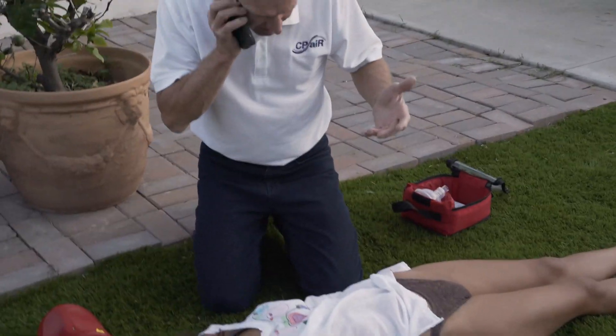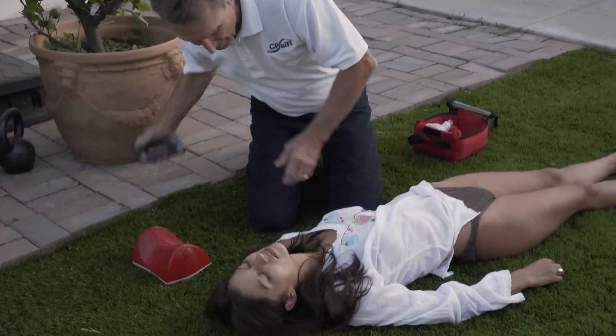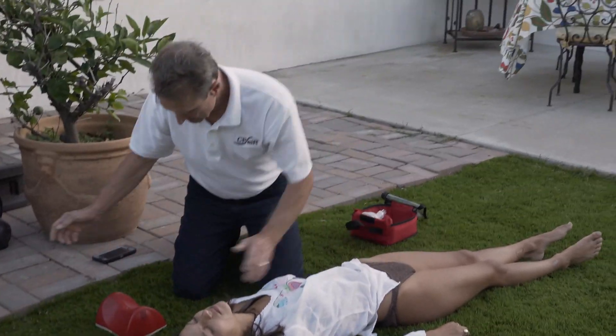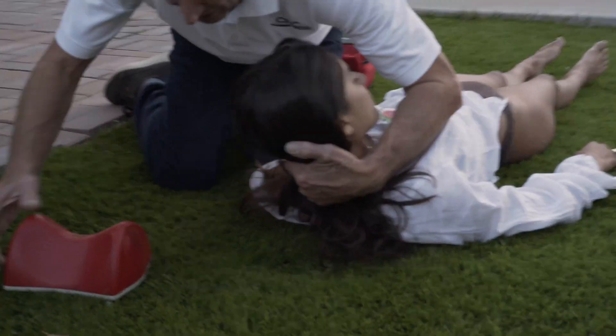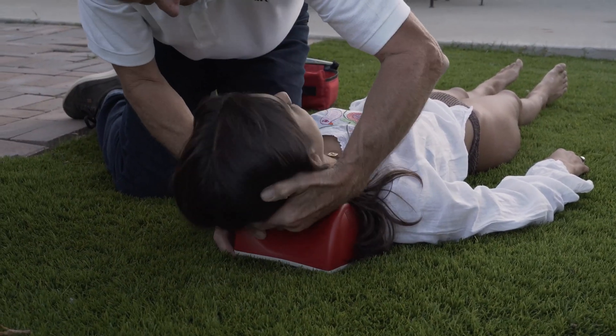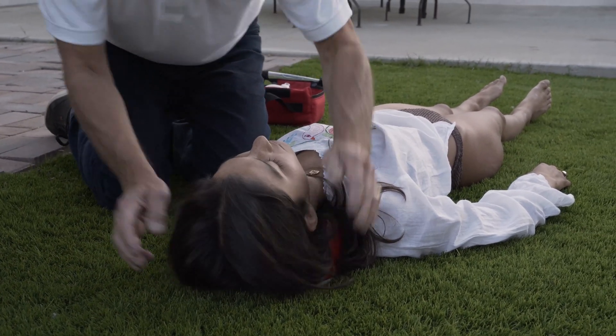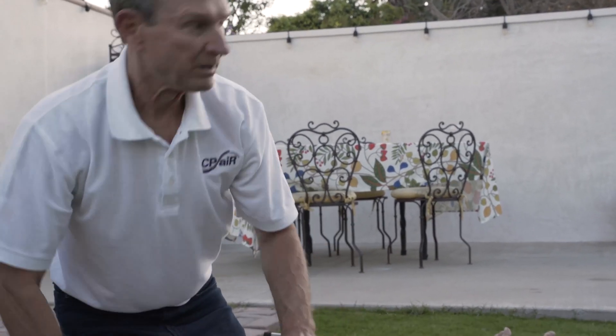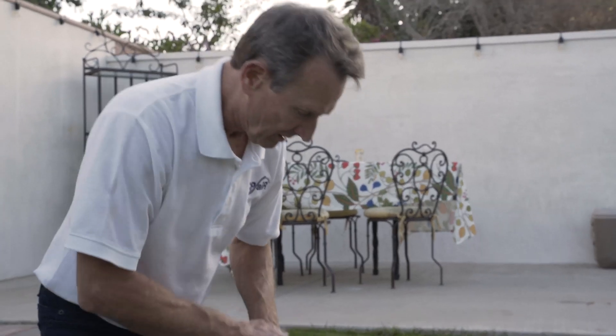Immediately call 911, or have someone close by call 911 for help. Check for consciousness by lightly shaking and shouting at the person. When your PAL directs you to place it under the victim's neck, notice the body outline and position it correctly. Note that when placed correctly, the victim probably covers up the built-in sensor and triggers the prompts to continue.